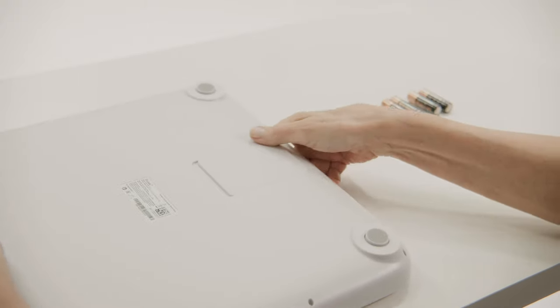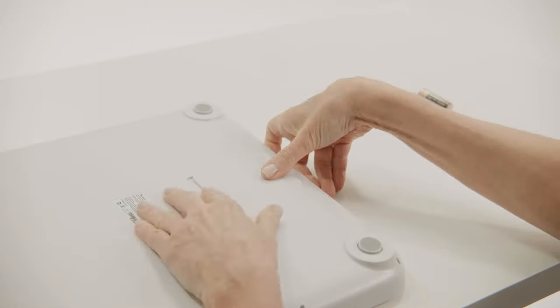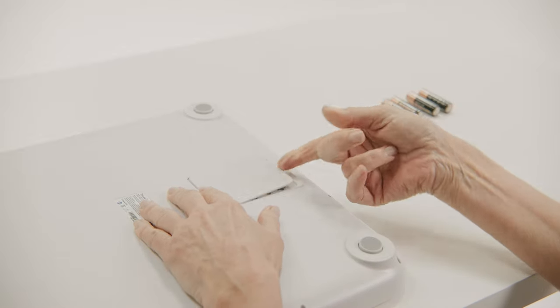We're going to walk through how to properly take a weight reading at home using a remote patient monitoring scale. Open the battery compartment at the back of the scale and insert the provided four AA batteries according to the instructions marked inside.